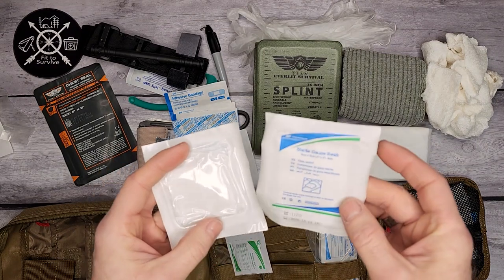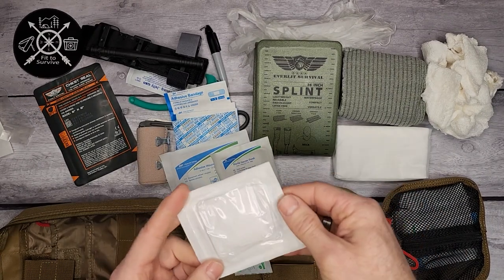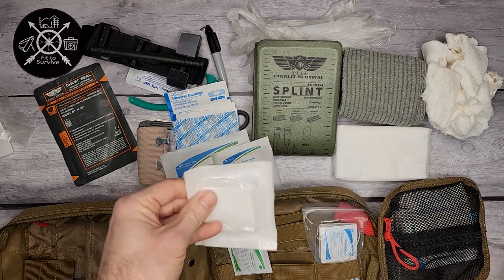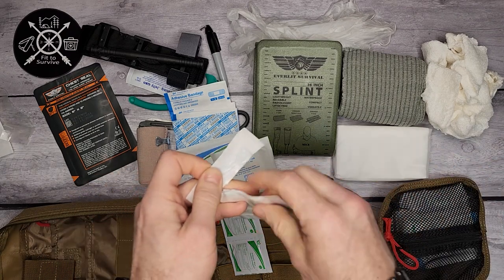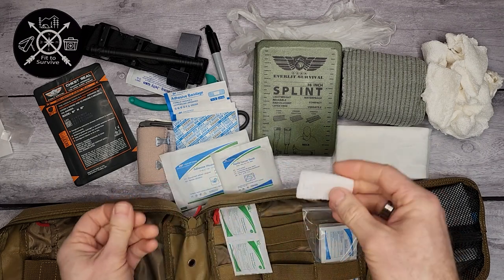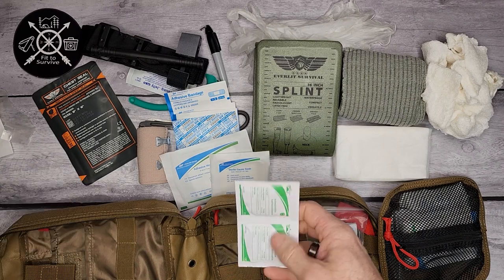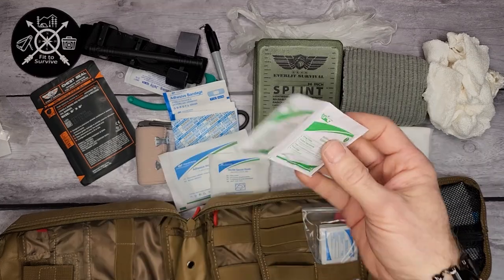Then you have some small gauze swabs — literally just a small amount of gauze meant for cleaning a wound or whatever else. And the last thing in the back section is antiseptic wipes.